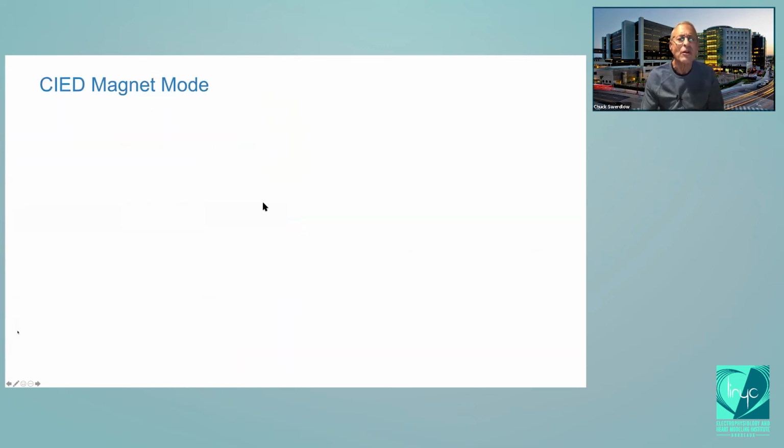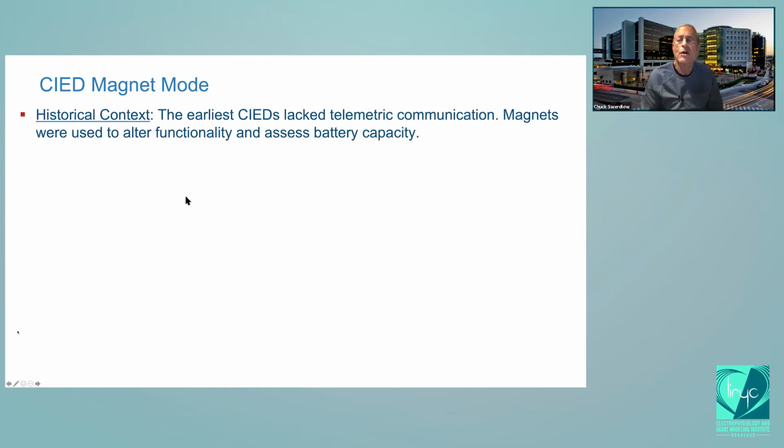All right, I want to spend 1 minute on magnet mode, because we put magnets on pacemakers and defibrillators. Why do we do that? Well, what is the historical context?